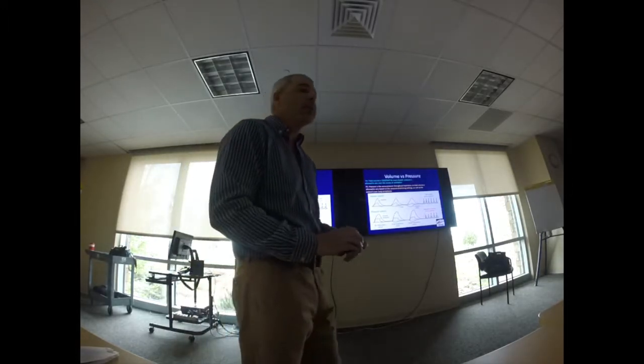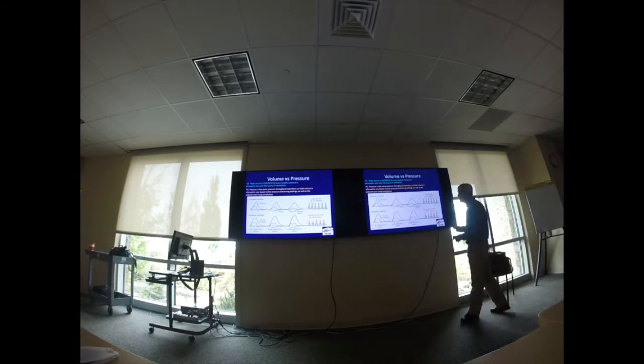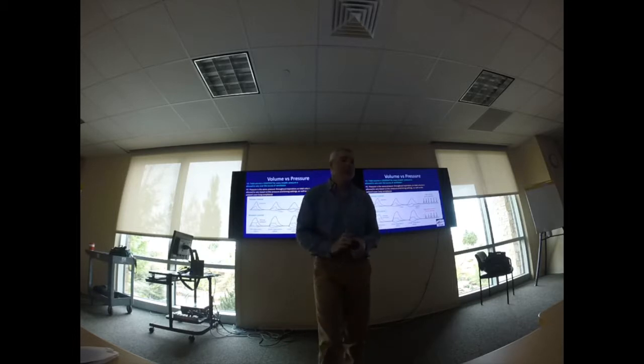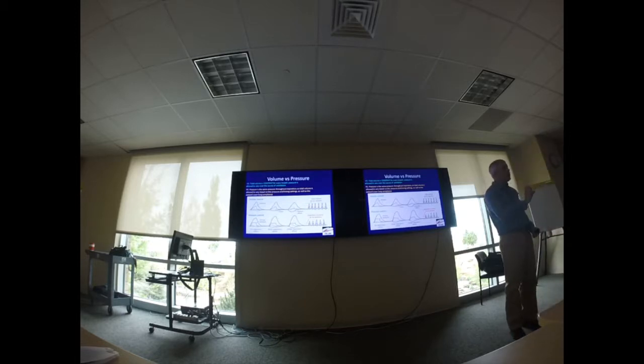When I put somebody on a pressure control mode of ventilation, I'm very cognizant of my expiratory tidal volume. Usually when I use pressure control, it's somebody who has a stiff lung, and I set that pressure to give somewhere around 6 cc's per kilo. I look at my expiratory tidal volume, and if I really want to give 500, I set my pressure to obtain about 500 based upon what I'm getting out. Does that make sense to you guys?